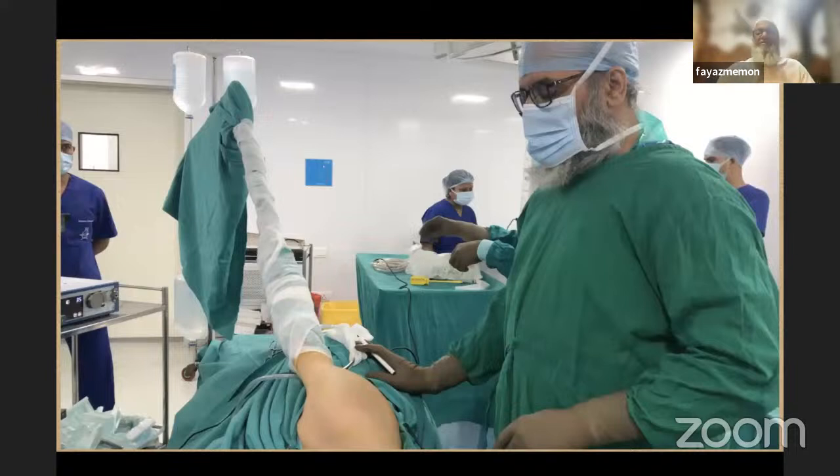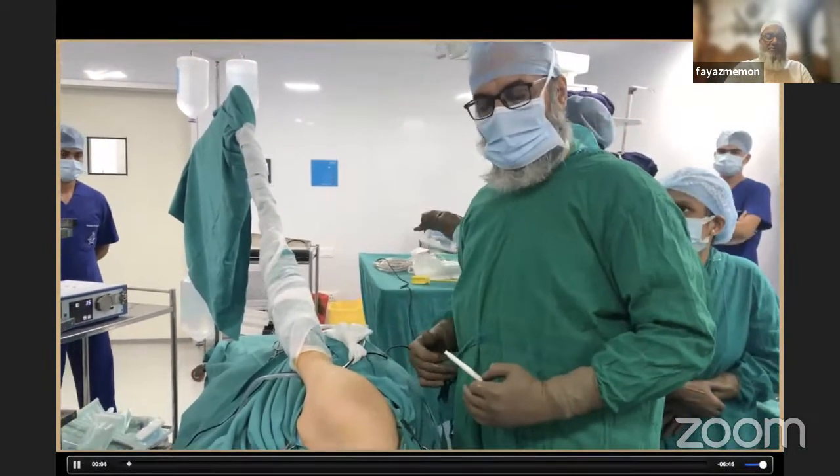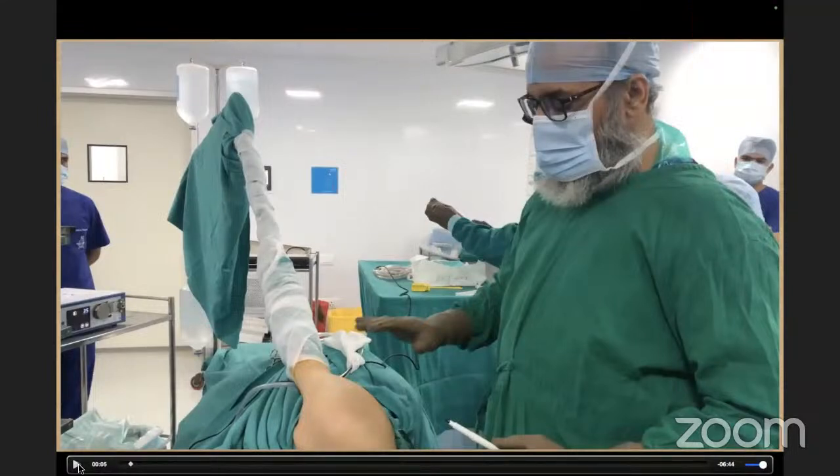This is a live case in which I'll be demonstrating the shoulder. In case you are not able to hear the volume, please let me know, then I'll have to start with proper commentary on this video. So this is the lateral decubitus position. I'm standing on the posterior aspect of the patient. Could everybody hear this video volume? Yes, we could hear it.